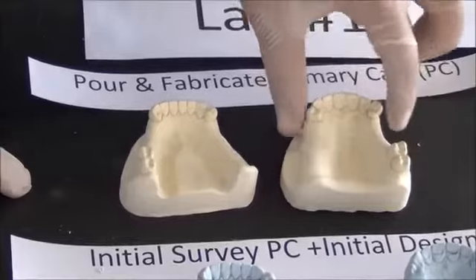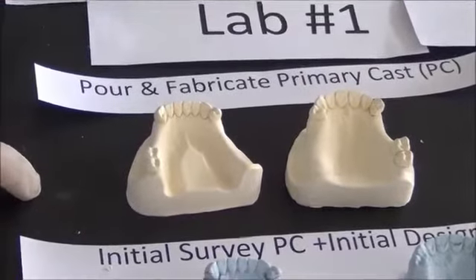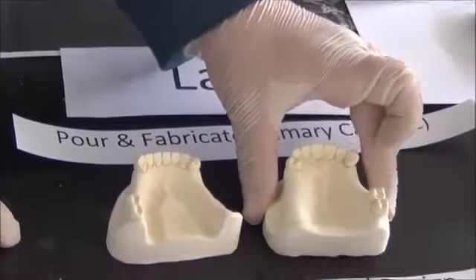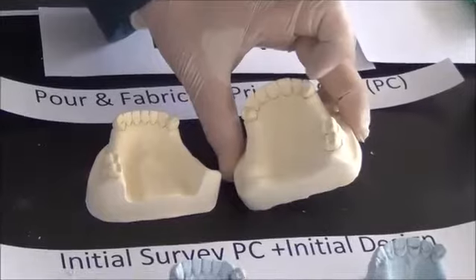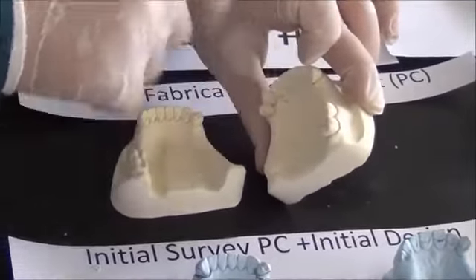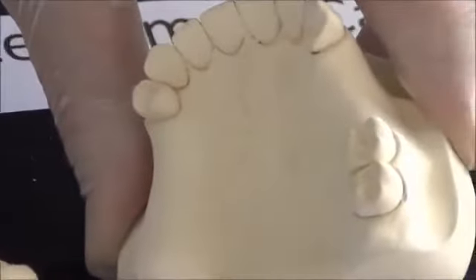Where am I going to place the teeth? Where am I going to place the components of the chrome cobalt that you have taken in your lectures? So I have to study this well. Studying it by vision will not be sufficient, because I could not see if there is an undercut and how much it is. I could not gauge it by vision. I need something more specific.